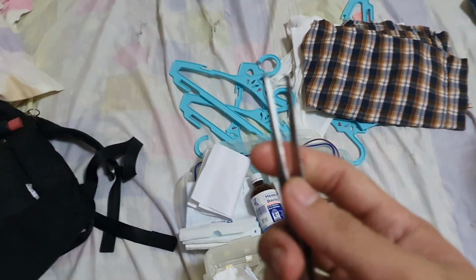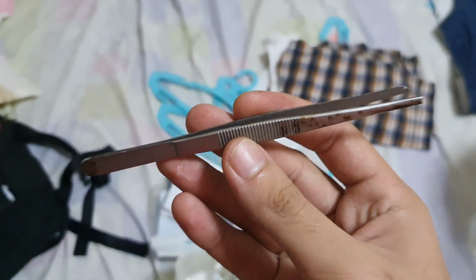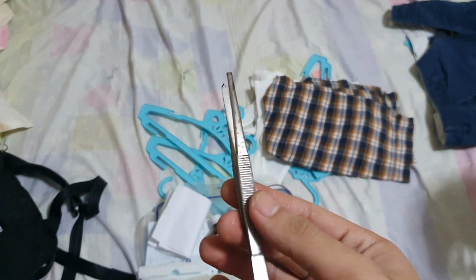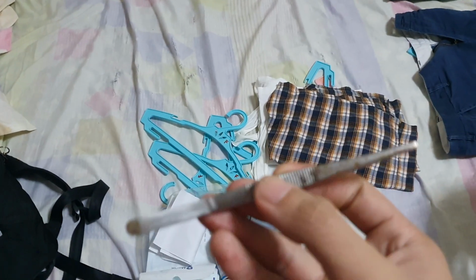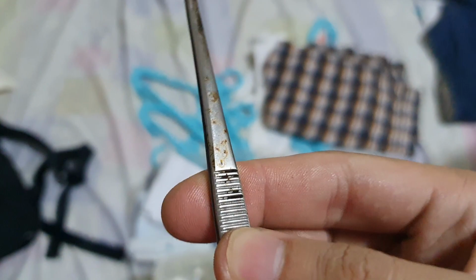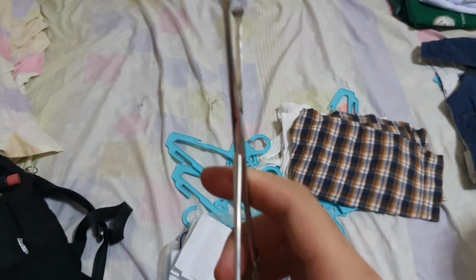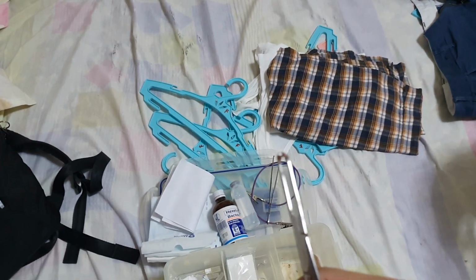Okay, never mind. So this is the forceps. I know it's dirty, I have to clean it, but yeah. I am not using this one on a live patient. The one I used for the live patient is back there in school, but I couldn't get it. This is the tissue forceps to prevent bleeding. And then this is the forceps also, the tissue forceps to control bleeding as well. I am not using this one on the live patient, as you can see.